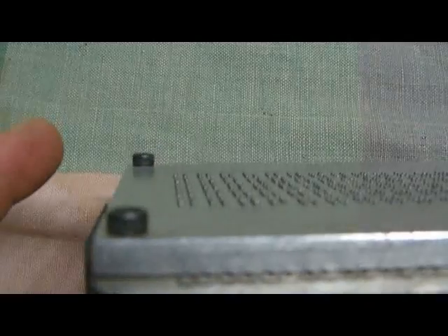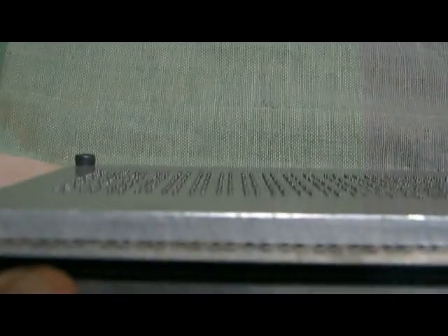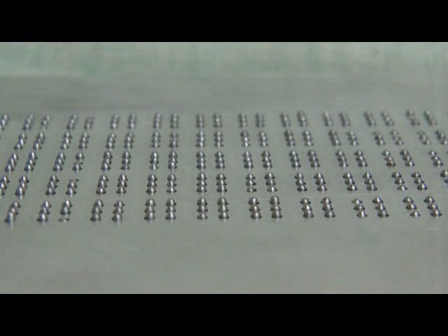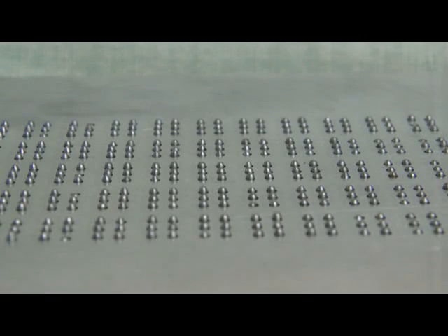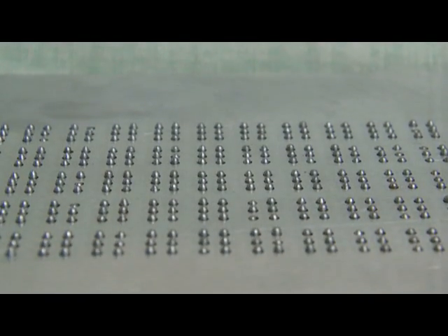Now, how I control that is, you can see the pins now. I think we should be able to zoom in at an angle and show you. Okay, I think you can see the pins fairly clearly here. Okay, I think if I drop the pins on this row closest to the camera, you can see it fairly clearly jumping up. Okay, that's using gravity, so some of them are not falling properly, but that's more than amply evident that they can have the ability to control the whole lot of pins.